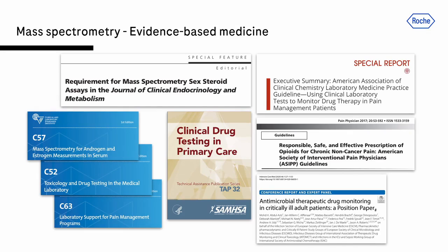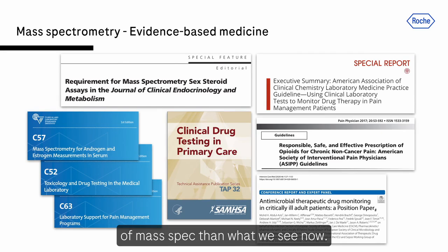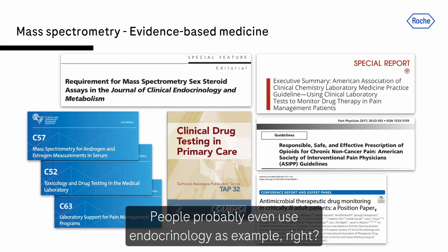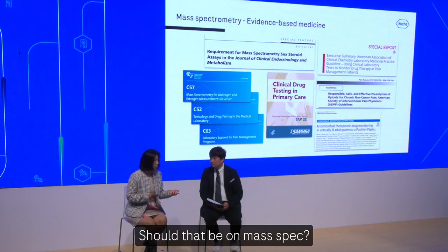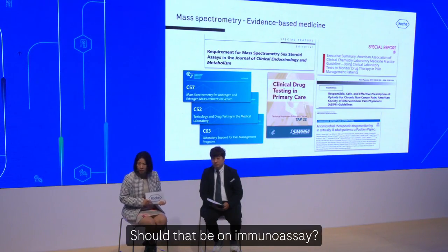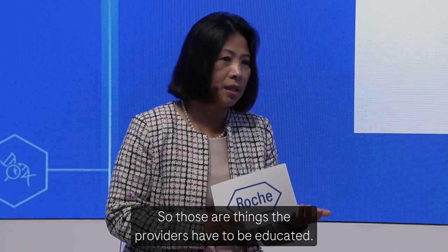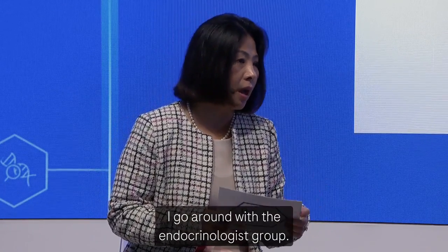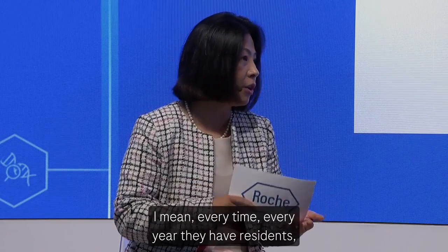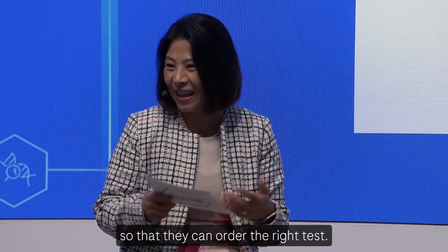I would say there are a lot more possible applications of mass spec than what we see now. People probably even use endocrinology as an example. Should you use testosterone, or free testosterone, or testosterone for women on mass spec or on immunoassay? Well, you can do that on immunoassay, but it's just not accurate. So those are things the providers have to be educated on. I go around with the endocrinology group, and every year they invite me to talk to their residents about mass spec so that they can order the right test.